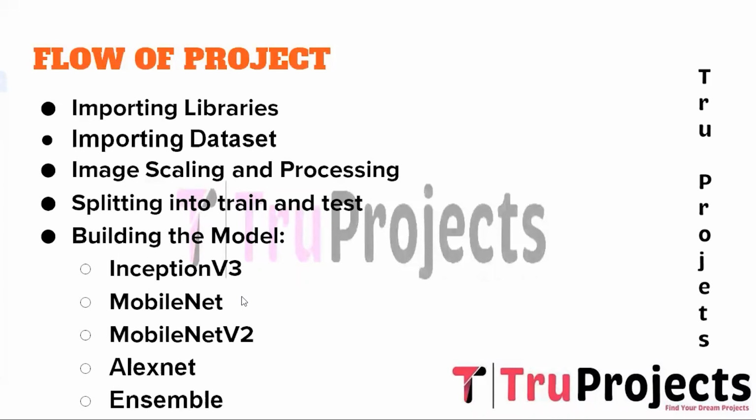In this project, MobileNet will be utilized to develop a computationally efficient model for detection. A streamlined structure ensures faster inference time without compromising on accuracy, making it a valuable candidate for real-time application. And the third one is MobileNet V2, which is also an improved version of MobileNet, further optimizing the efficiency and accuracy of the deep learning model.